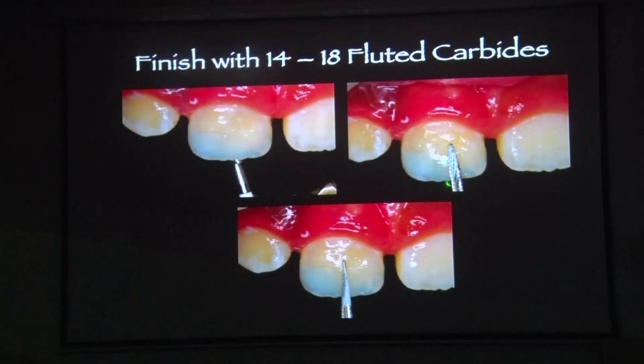So of the same burr, I am going to use a 12-flute and a 30-flute. Palatal, I am going to use a football. Cervical, I am going to use a short needle. So I need 3 different burrs with 2 different grits. So basically I need 6 burrs of same shapes but different grits. And always do dry because you want to see what you have done. No water coming in from the air rotor port. Off it, do it dry.